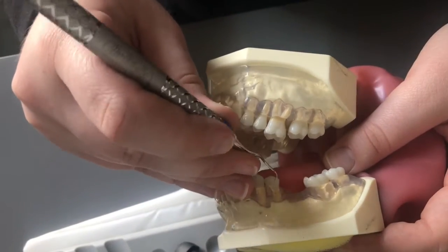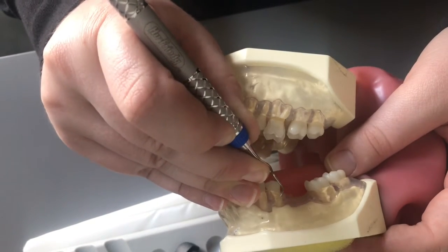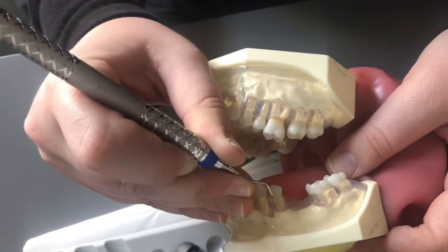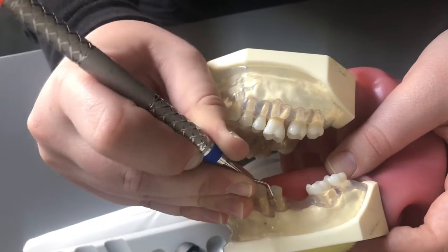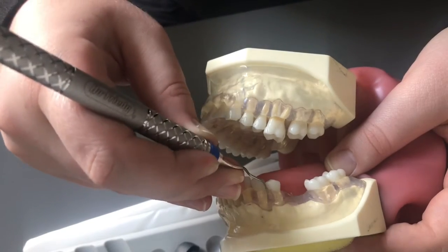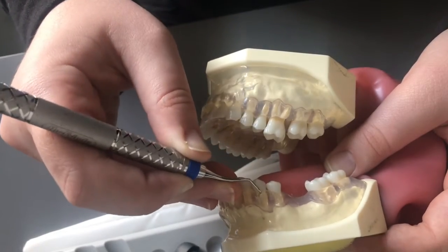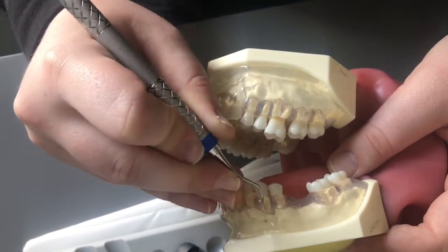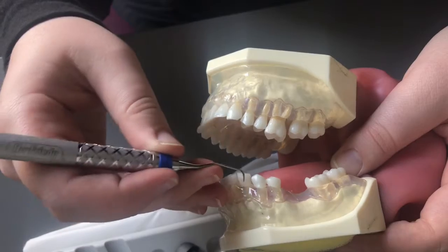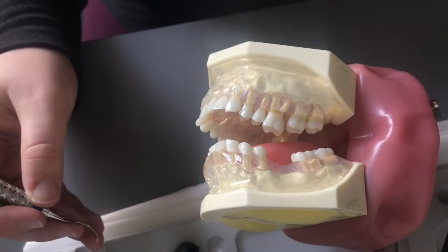Skip over the missing tooth. And really roll with that fulcrum. Insert at that 0 degrees and then come up on your fulcrum, bringing the instrument around. Alright, and that was my left mandibular facials.